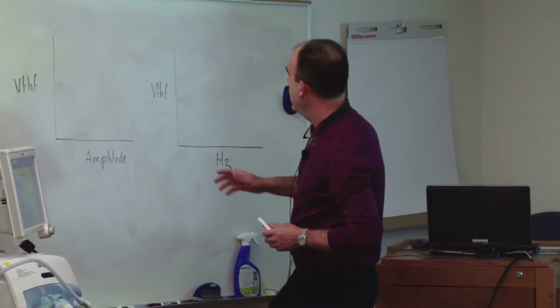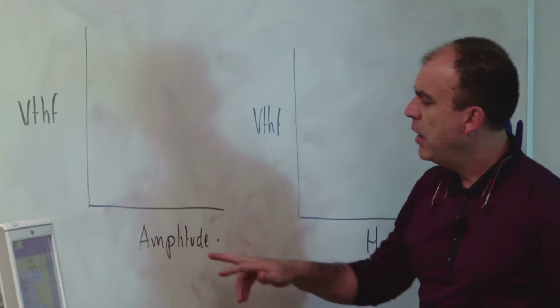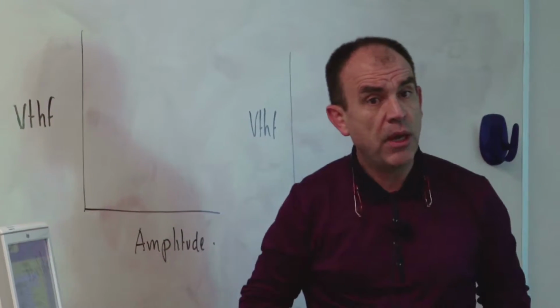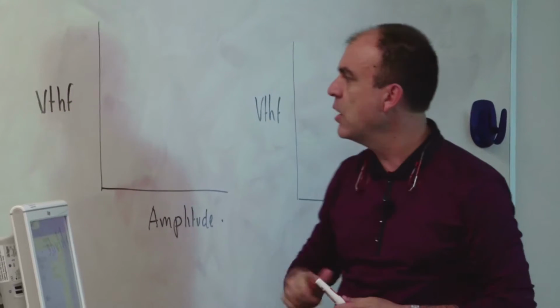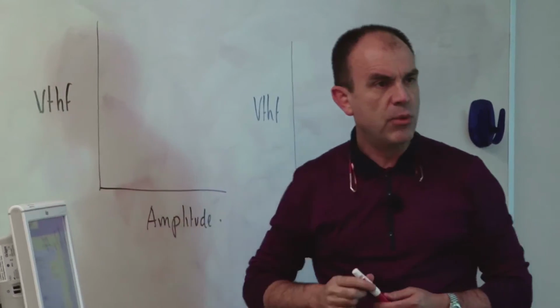Basically what we wanted to test out was the relationship that each of them had with amplitude and the parameter that we talked about yesterday, which is kind of a new parameter when you shift from the Sensormedics to these type of ventilators, which is what we call VTHF, or tidal volume in high frequency.